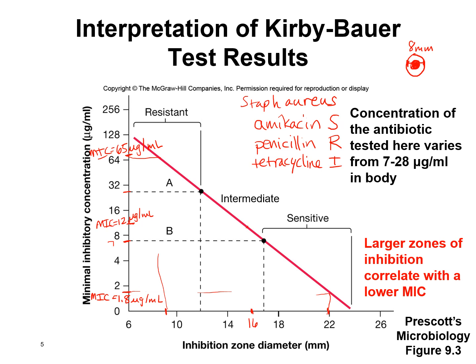It just depends on the level of antibiotic, because it's kind of right in the middle of that range. If you're on the high end of the range, you could be above the MIC, but if you're on the low end of the dose range, you may be below the MIC, and that antibiotic might not work. So that's the Kirby-Bauer disc diffusion test, and that's how they report out the results that you get back from the lab. They'll put susceptible, resistant, or intermediate, and then clinicians can use that information to choose which antibiotic they're going to use to treat the patient's infection.